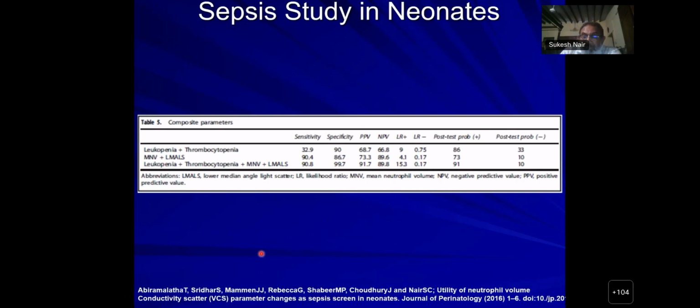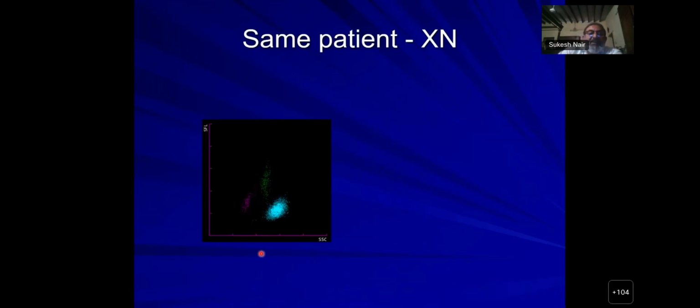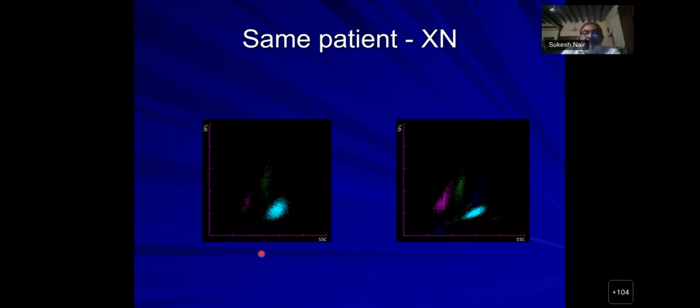So this was published in a Nature publication, and it was quite a significant study. Now, the same patient, we ran the sample in Sysmex, and you can compare it with normal. This is normal.